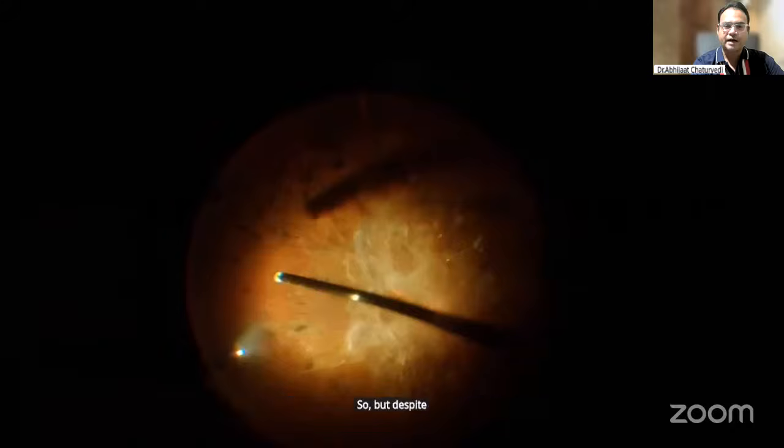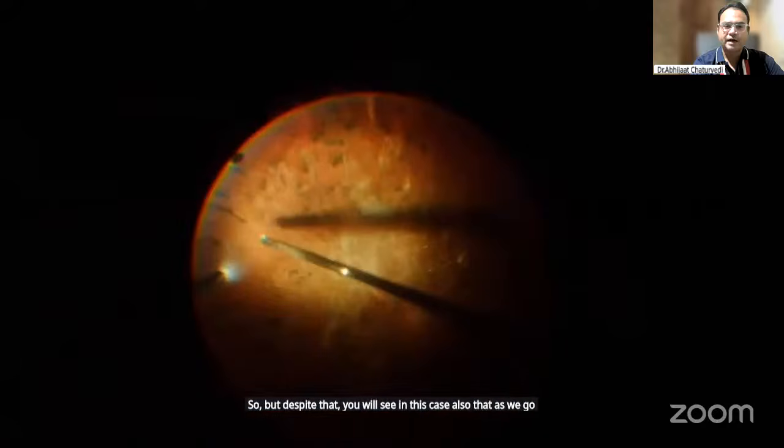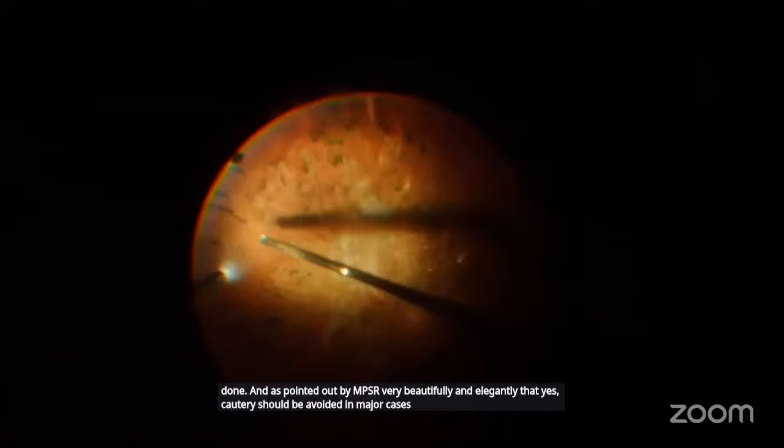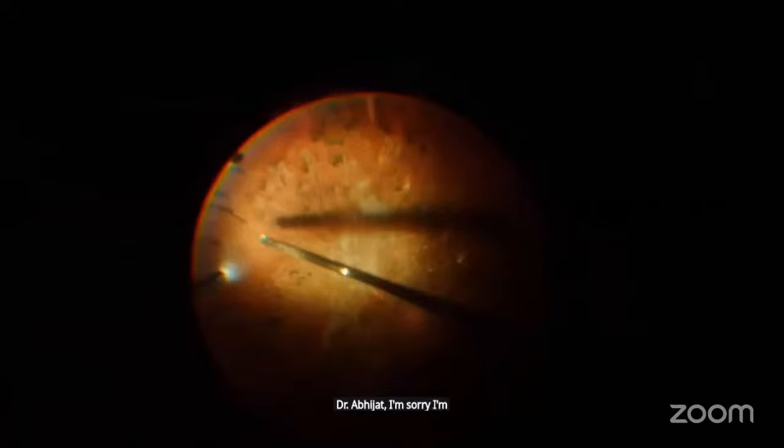But despite that, you will see in this case also that as we go ahead with the dissection, there are some bleeders. So very careful cauterization is done. And as pointed out by MPS sir very beautifully and elegantly, cautery should be avoided in major cases. Dr. Abhijat, I'm sorry, I'm interrupting. You can just cauterize the tip of the vessel, and that should stop it. Dr. Abhijat, there's an issue with your video, I think.